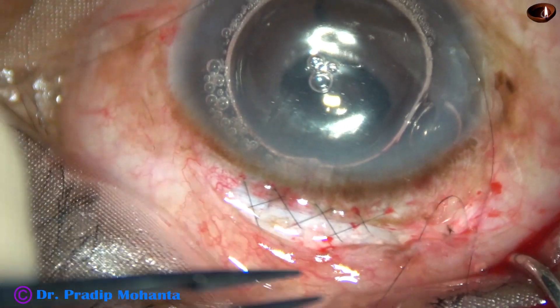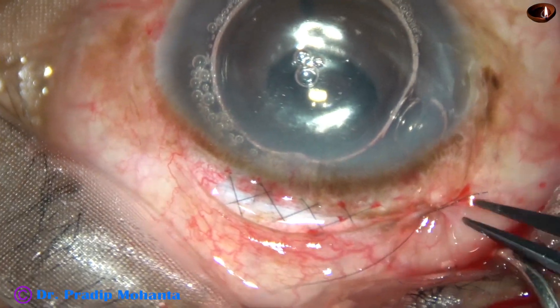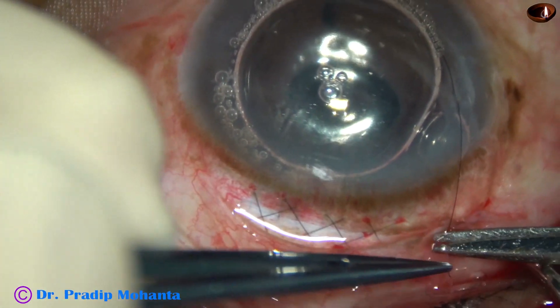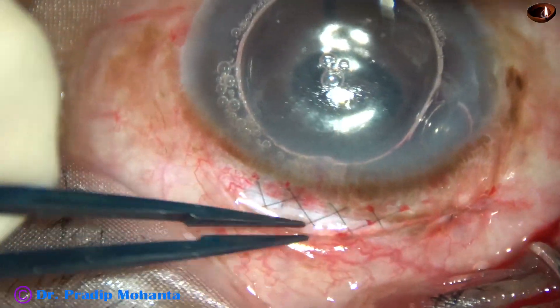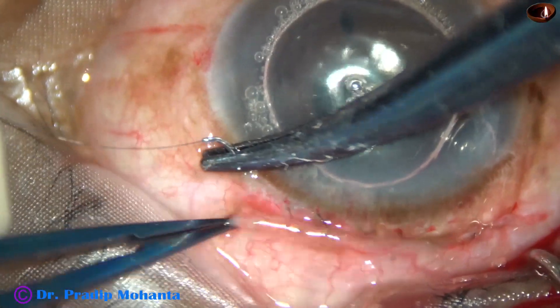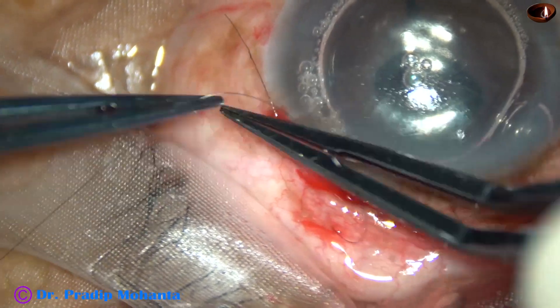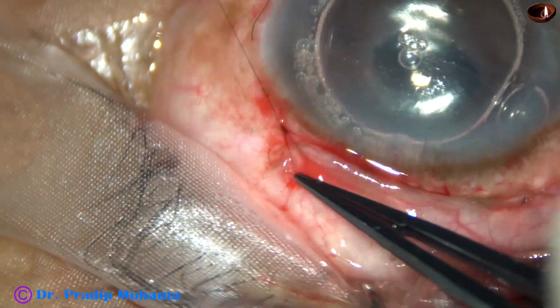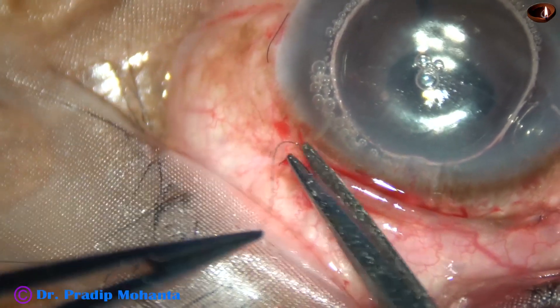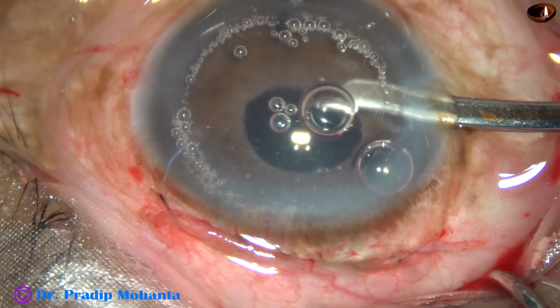And now the conjunctiva is opposed to the limbus. At the right end, this is an X-suture. I don't bury the knot because I remove this conjunctival suture after 5 or 7 days. But if we plan to keep this suture, we can bury the knot. This is a single suture. And now this is the final lavage of the anterior chamber.